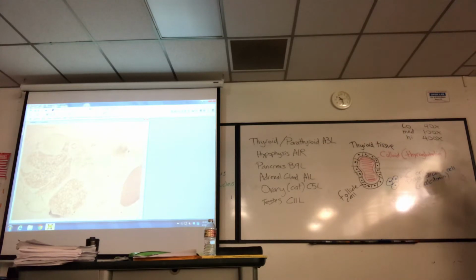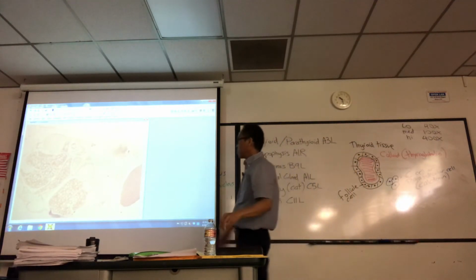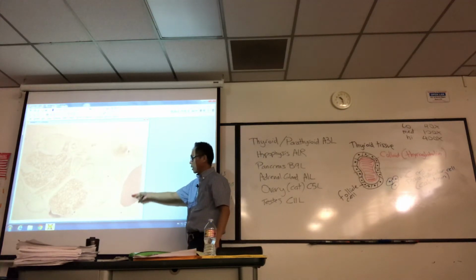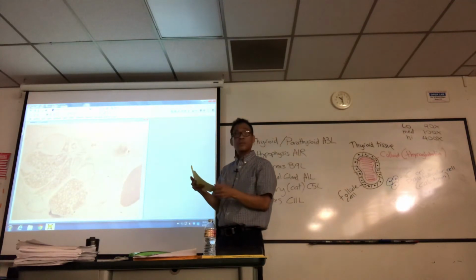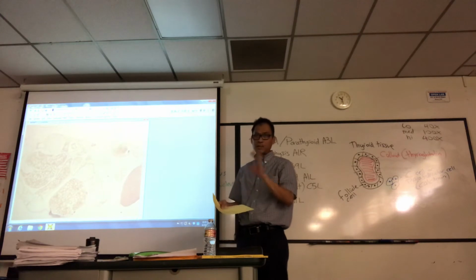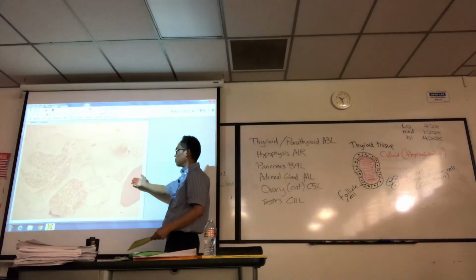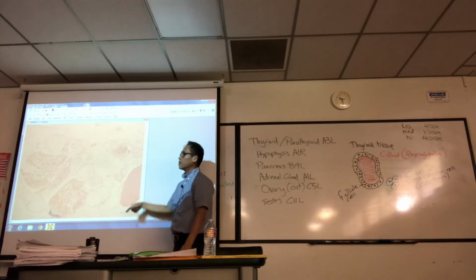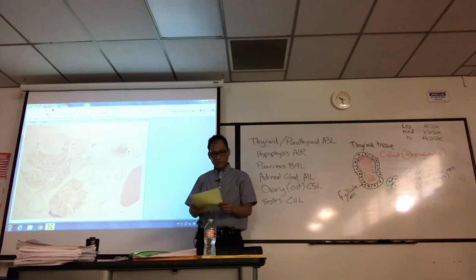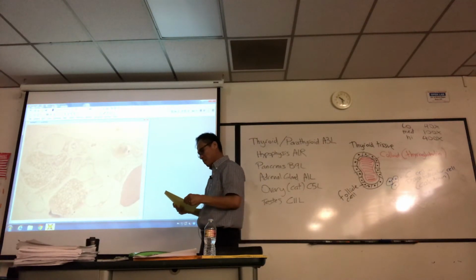This is thyroid parathyroid. These 2 glands are right next to each other, and you can see both on this shot of low mag. See the purple splotch here? Those are chief cells. That's the parathyroid gland. On your study guide, it says chief or principal cells, and on today's quiz, the hormone they secrete is PTH. Okay? So under low mag, I might say identify parathyroid gland. I might say, what kind of cells are in here? Chief cells. There's other kinds. You only have to know chief cells. There's oxyphil cells. You're not responsible for those.